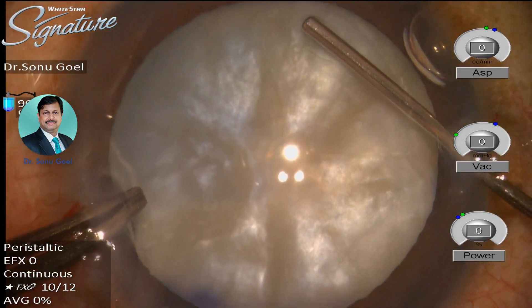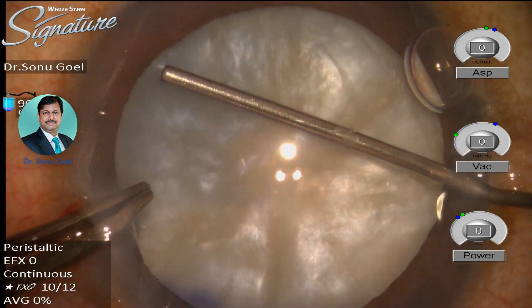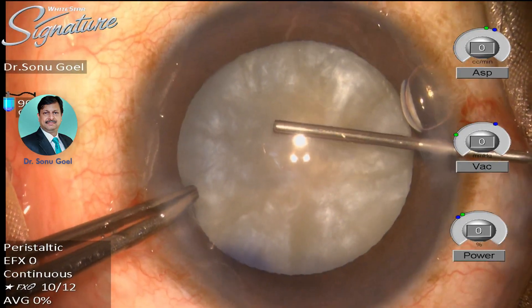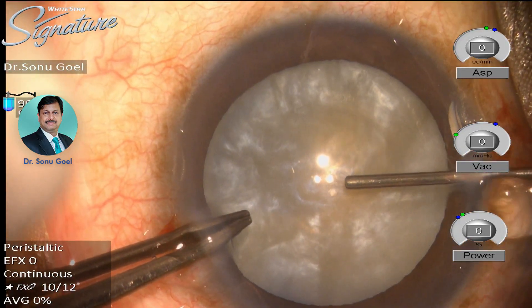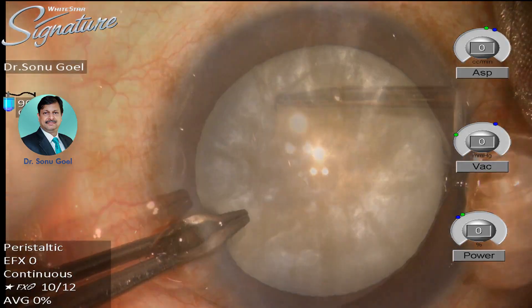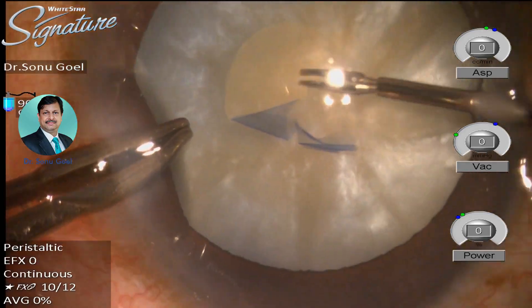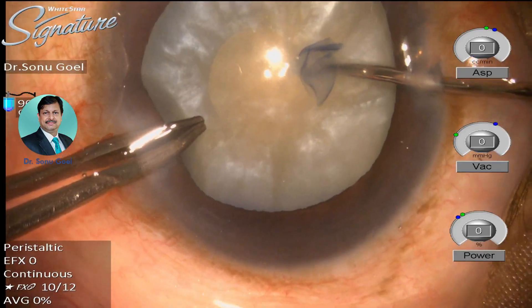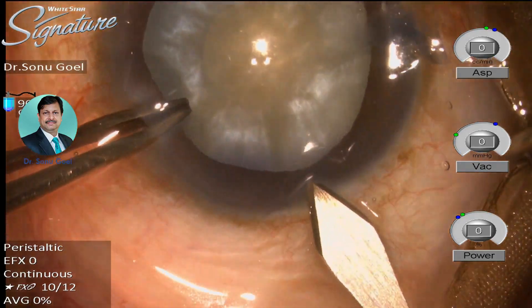After pushing the healon inside the anterior chamber, we give a small nick and side strokes. The basic aim is to manage the convexity of the anterior lens capsule — to make it flat — and by this slow decompression and pushing in the healon, the anterior capsule is flattened. Then using a side port with microrexis forceps, once the anterior capsule is flattened, a very careful round regular capsulorexis can be fashioned in these patients.